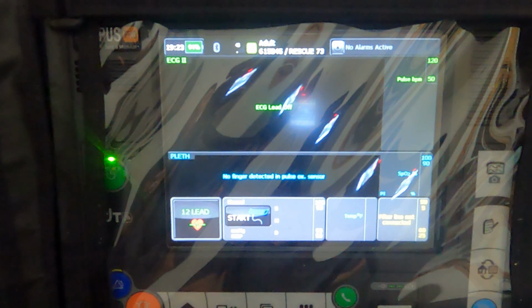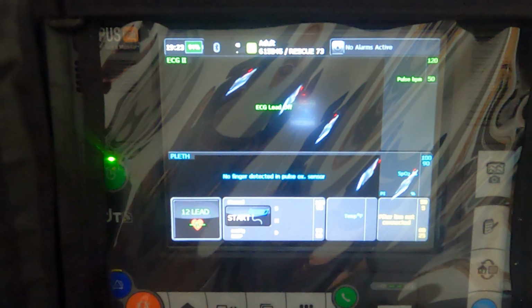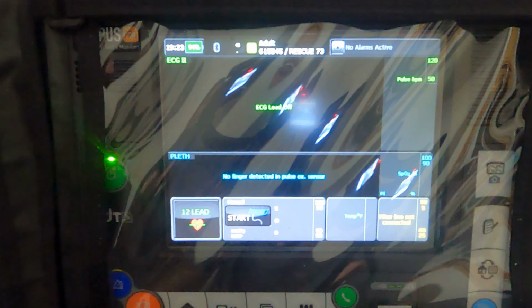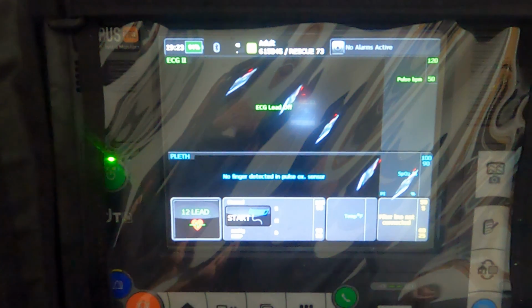Hey guys, this is the last video of the series for the new Tempus Pro monitor. So the last thing that I want to show you guys are some of the things on the touch screen that I touched on in the other videos, but I really want to get a little more in depth on what you can do with this.